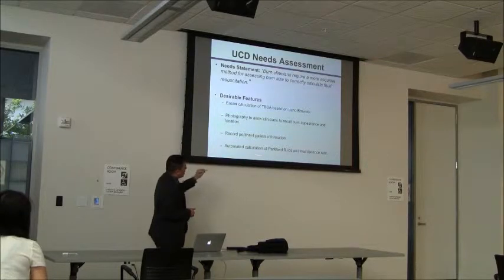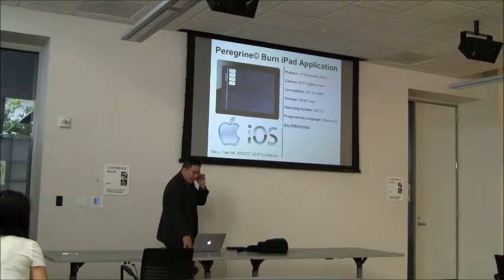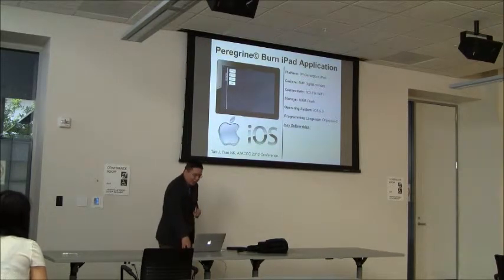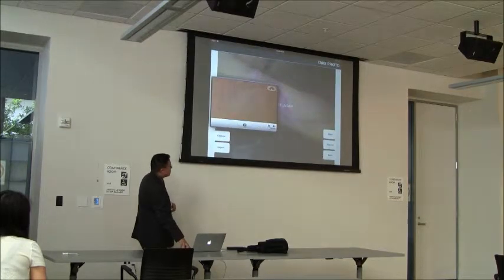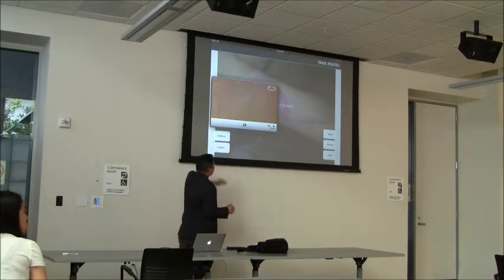We also want to be able to automate the calculation of the fluids that are needed to avoid typographical and mathematical errors. So these students, of course, pulled off the iPad. Maybe there was an excuse to get an iPad, but we got them an iPad anyways, and they did a great job at coming up with this device. This is the main screen for it right here. You push the button, take photo, and it uses the same features that are very familiar to everyone in terms of iOS-based devices.